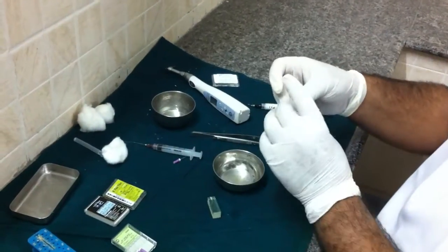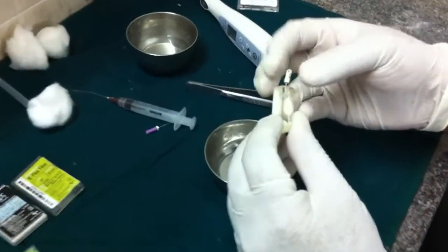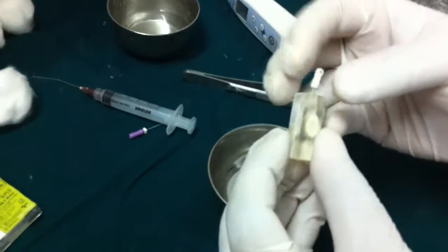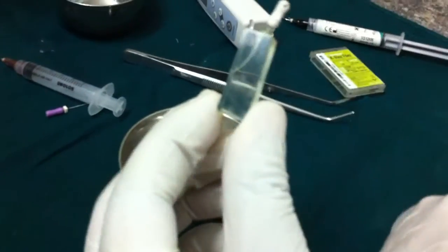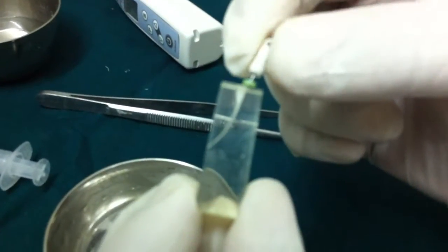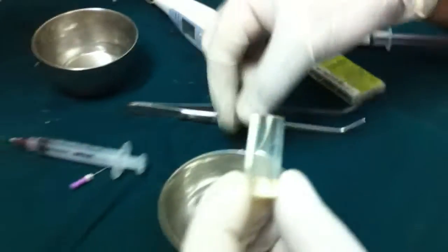After establishment of working length through an apex locator or any other method, use gentle watch winding motion till it reaches the working length. Gentle watch winding motion.